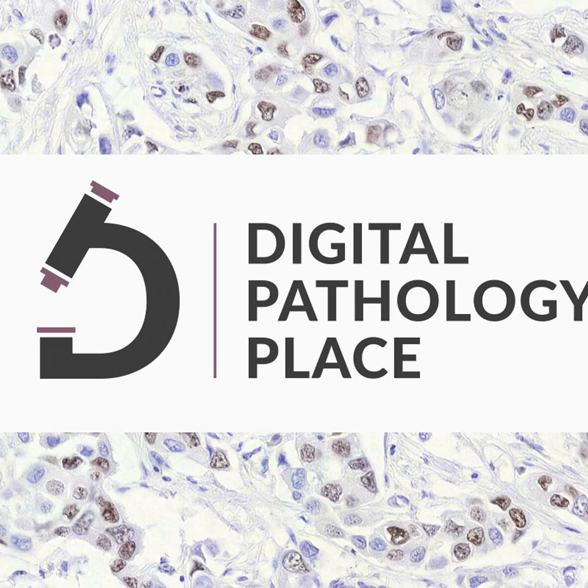The next is color augmentation, and this is in particular used in deep learning models. The goal of that is to increase the diversity in the source domains to teach the model how to handle different situations. So to make it more robust. The opposite of the stain normalization. Right. The third one is adversarial domain adaptation.